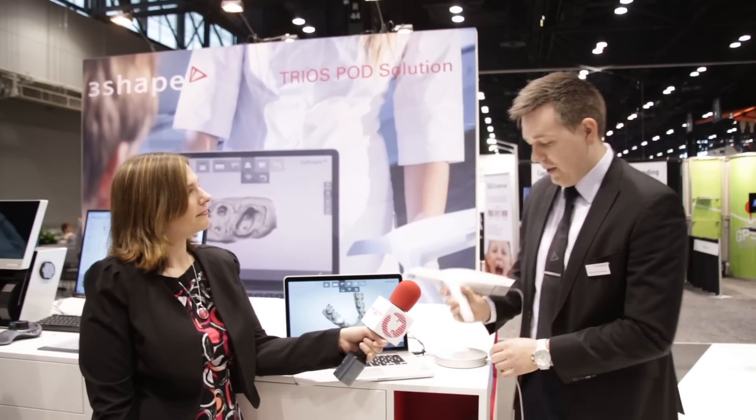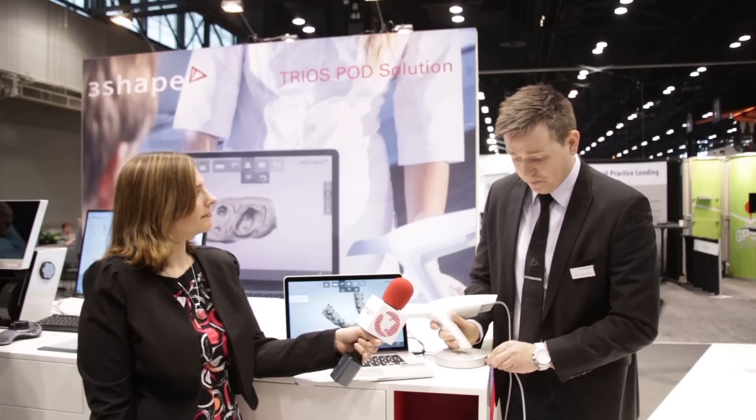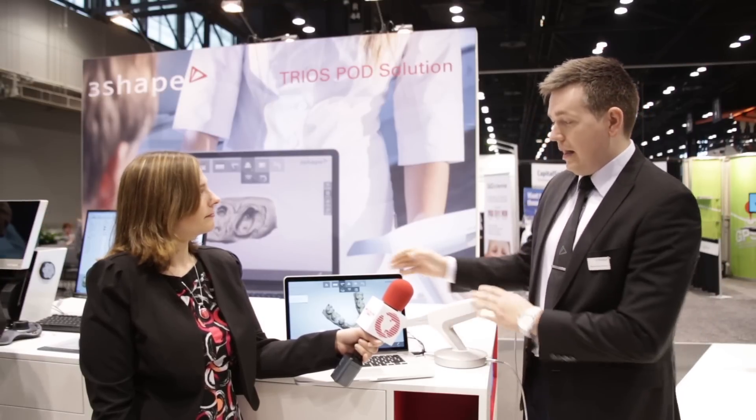I'm proud to present the TRIOS portable solution, which is a new configuration of the normal cart solution. With this solution you are able to bring it with you — if a dentist is working on multiple clinics, you just attach it, bring it with you, reattach it at the new location, and bring the laptop. Otherwise it's the same configuration and same speed as we know from the cart solution.